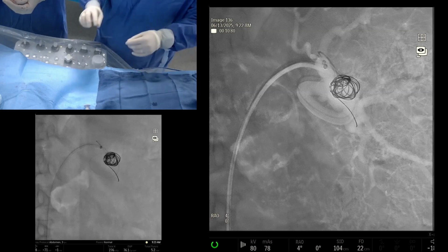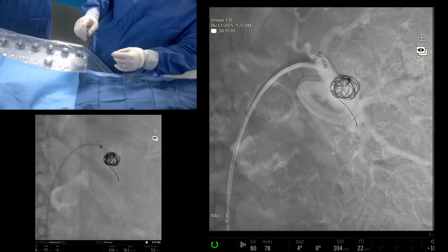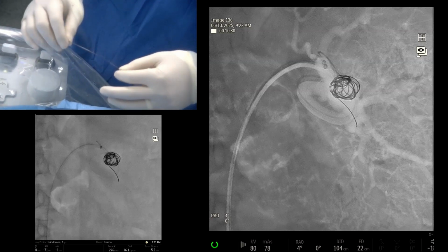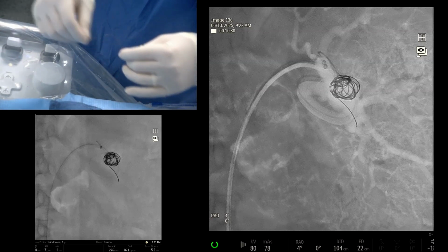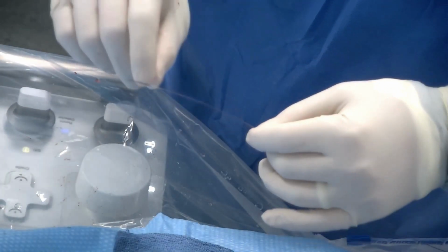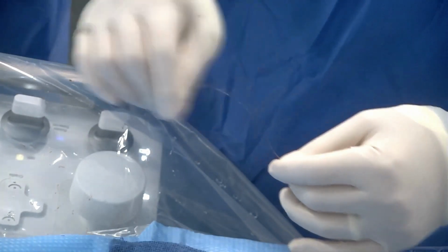This is a nitinol pushing system, so it works quite well, as both of you had mentioned, around the tortuosity, and it won't kink, which is sometimes a source of consternation for some people. I assume the camera is at my hands, and with nitinol you can really bend it back and forth and it won't kink. Sometimes with the older platforms with the steel mandrel, you'll be pushing against some tortuosity and you'll have a kink, and that really limits the ability to push through. So this is quite nice.